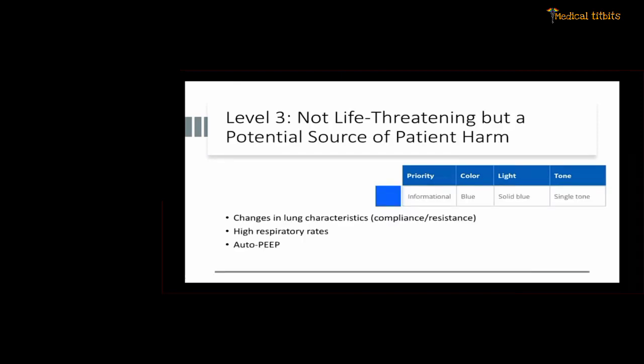Level 3, not life-threatening, but a potential source of patient harm, like changes in lung characteristics, like compliance or resistance, very high respiratory rate, development of auto PEEP beyond a particular level, etc. These messages or alarms should be color-coded with blue.